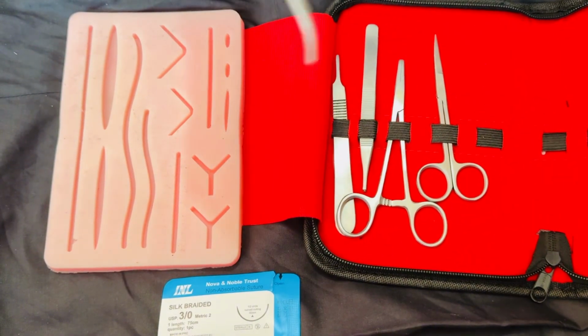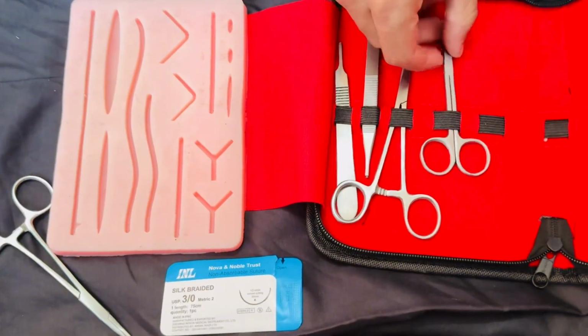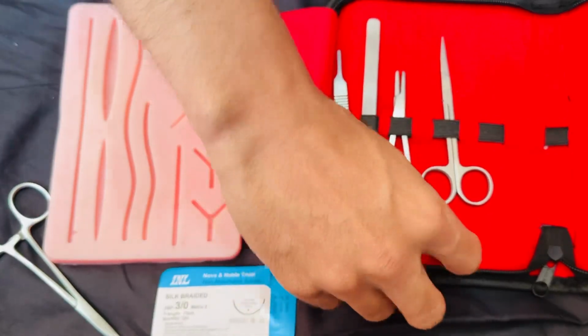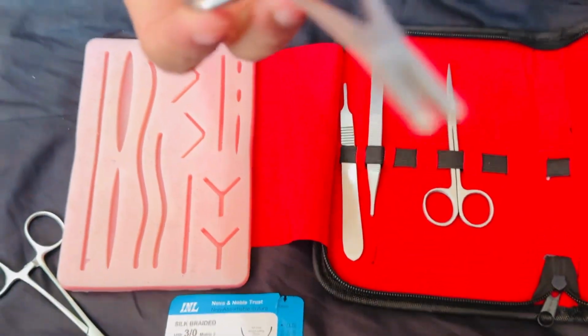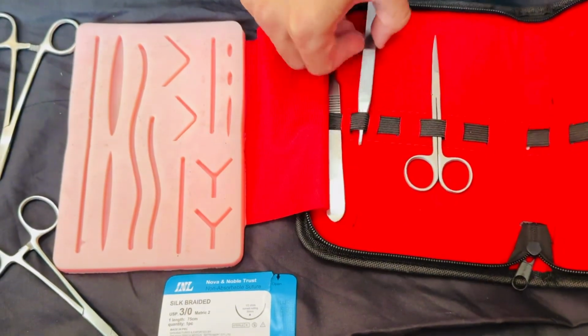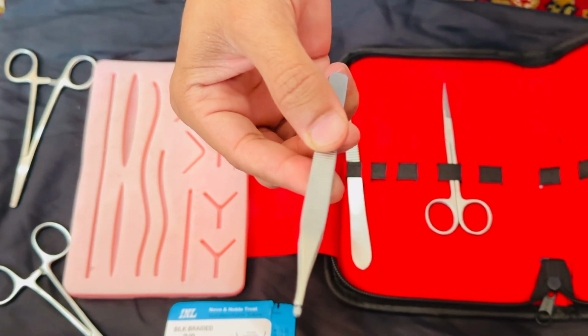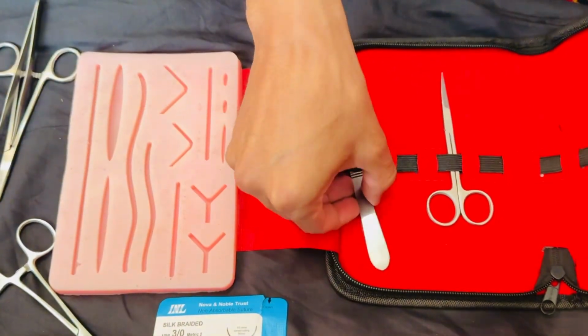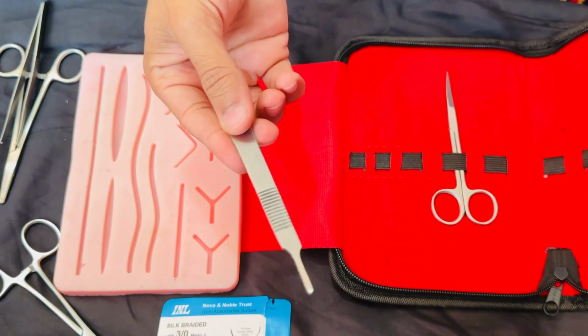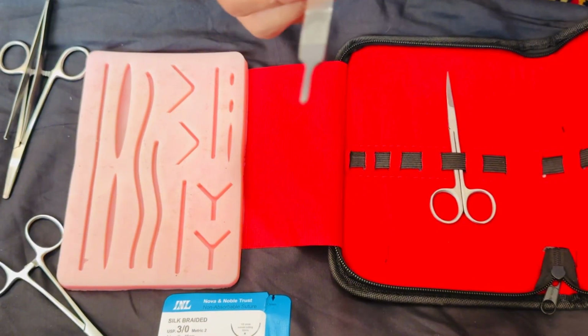So first of all, we have a curved artery forceps. Beside this, we have a scissor, and along with this is the straight artery forceps used for clamping or holding the arteries during bleeding or to hold the needle. And this is tissue holding forceps used to hold the epidermis or the dermis during surgical procedures. And along with this, we have a scalpel holder used for holding this scalpel, that is the surgical blade.